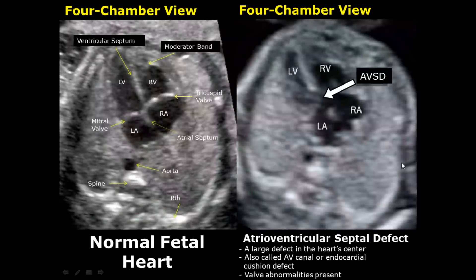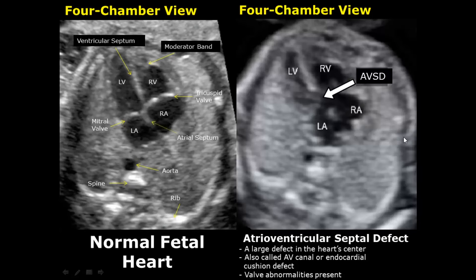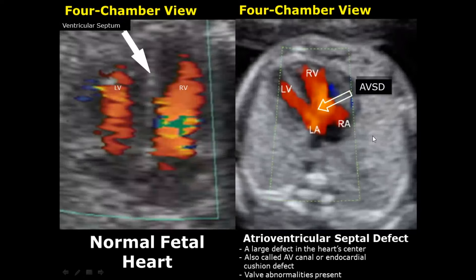An atrioventricular septal defect will have a large defect in the center of the heart. It is also known as AV canal or endocardial cushion defect. Because this defect is present at the level of the valves, there will be valve abnormalities present. On color Doppler, we can see the defect at the center of the heart.